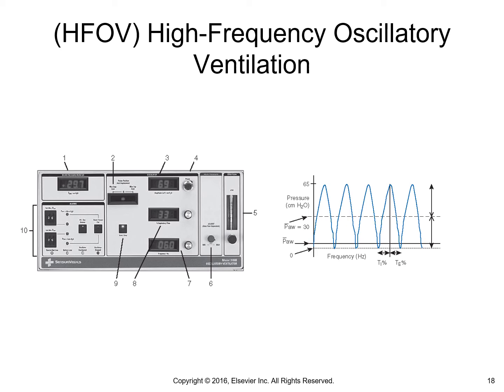Gas is oscillated back and forth by the action of the diaphragm, so that it actually moves back and forth, and you can see it when it's running. The amplitude of the wave, the depth of how much is going on, which is the power, is set by the power control and determines the forward and backward displacement of the piston, which then determines your tidal volume. So that's the basic concept behind it.